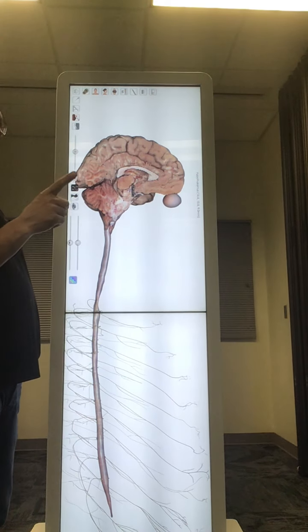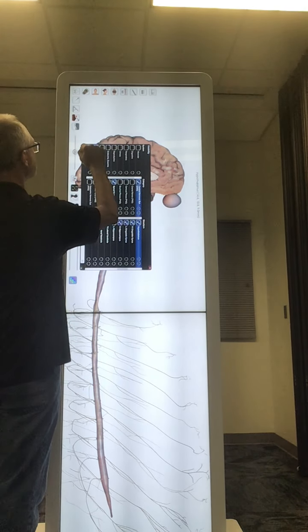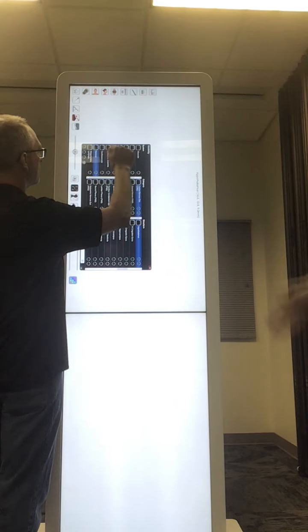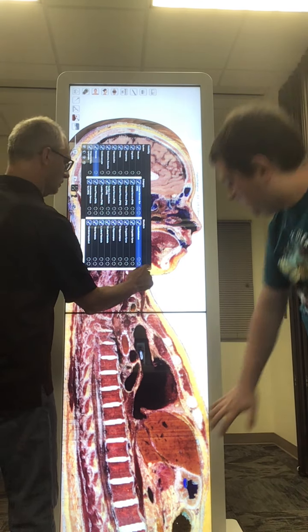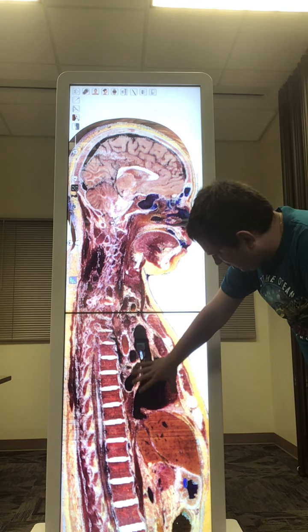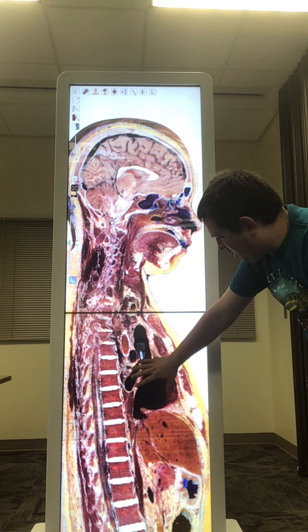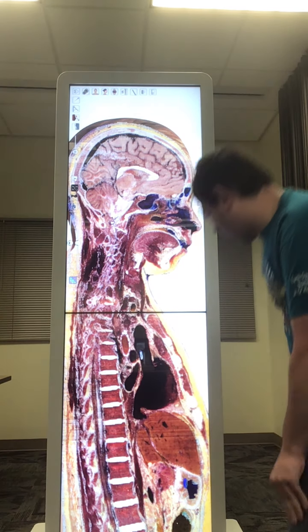All right, let's see if we can go back and do the heart, because that one is almost the same as the brain, very, very light. Oh, it's kind of interesting. There's a slice through your body. You can see the heart down here. That's liver, that's heart. So liver down here, heart. You can see how your backbone runs through here.